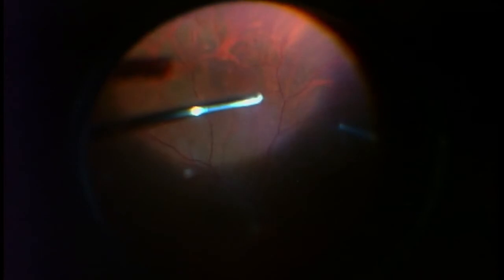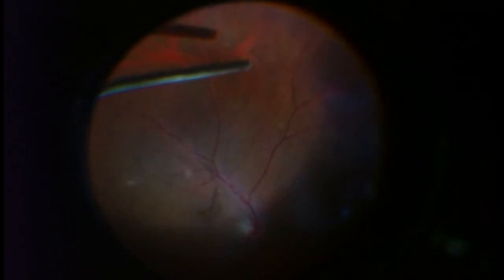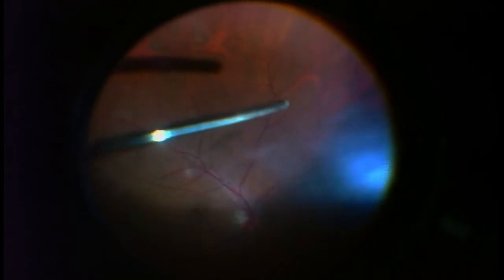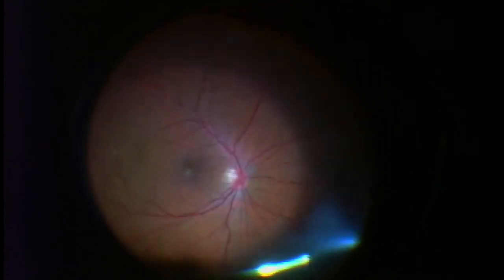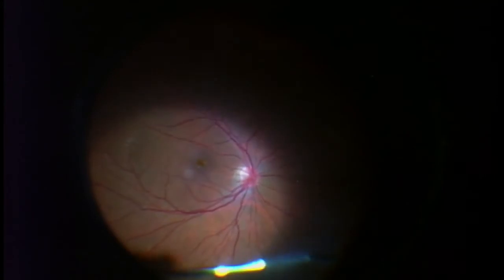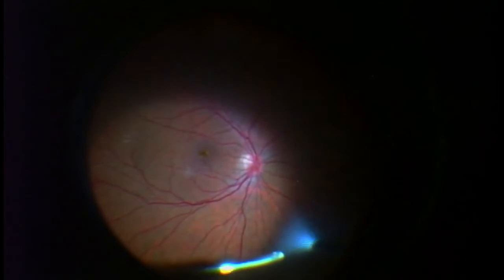Because he has had a PVD, I don't need to go to the posterior part of the retina and get near the retinal surface — I can stay relatively close to the front part of the eye. As you can see with the Weiss ring, the vitreous actually comes to my vitrectomy instrument. So I just go in a circular pattern around the peripheral retina, doing this rather slowly and deliberately, trying to limit unnecessary movements.